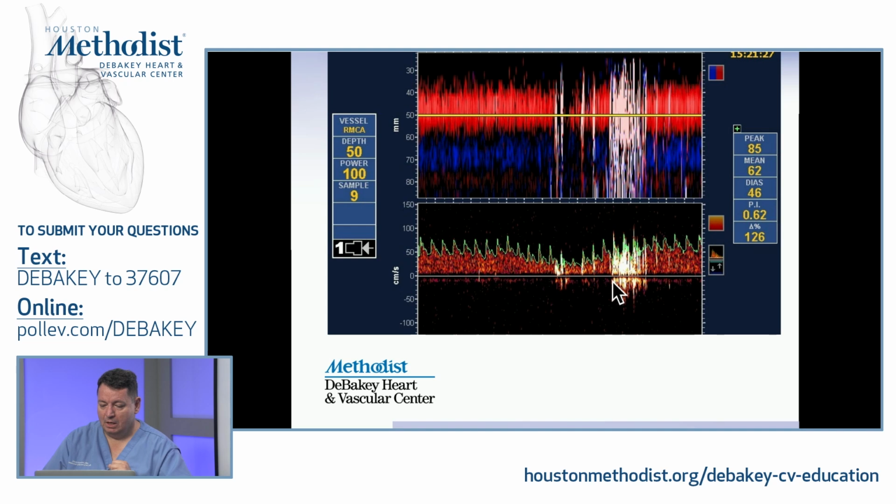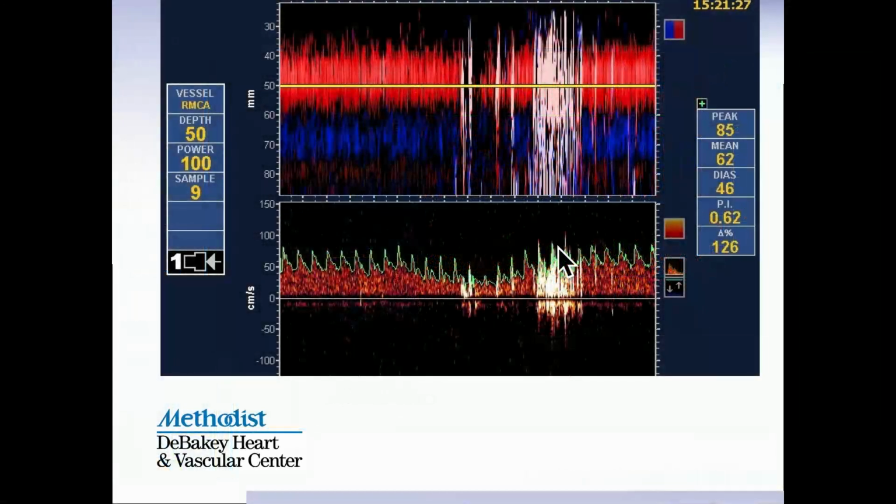Yes, here you go. When you see that Valsalva effect, you don't need any Valsalva meter, because even if you have a Valsalva meter with 40 millimeters of mercury pressure, that means your glottis is already open. Yes, you have a tube and you are keeping the pressure on, but keeping the pressure in that Valsalva meter is already letting some air out. So you want to avoid that air going out.